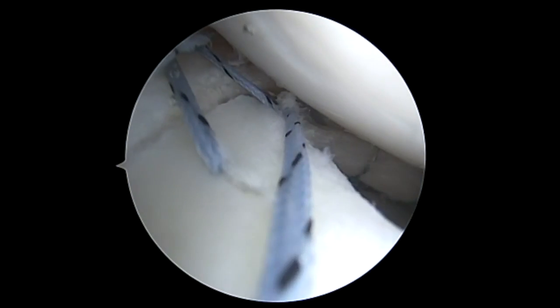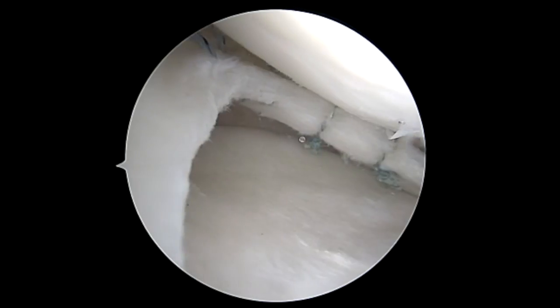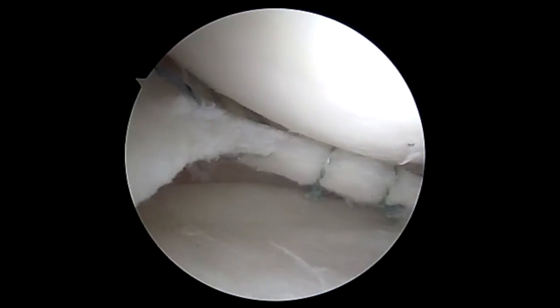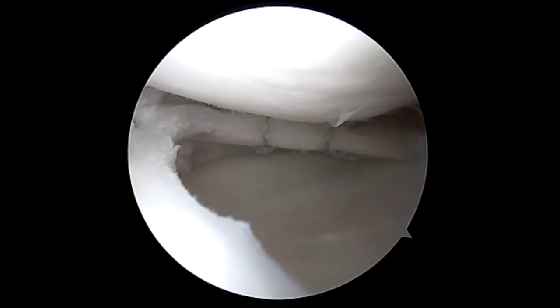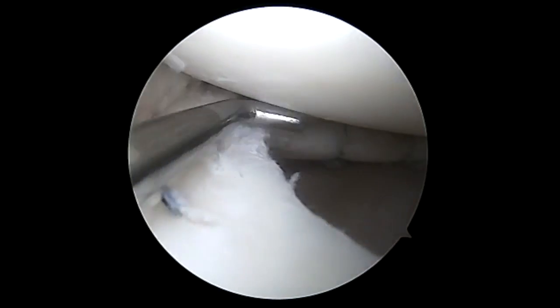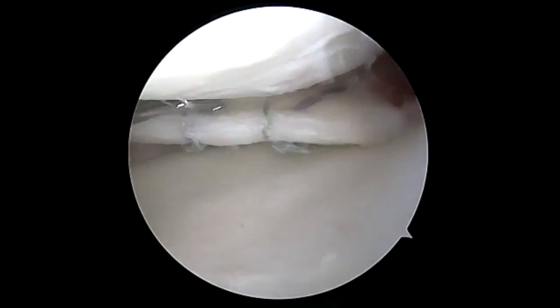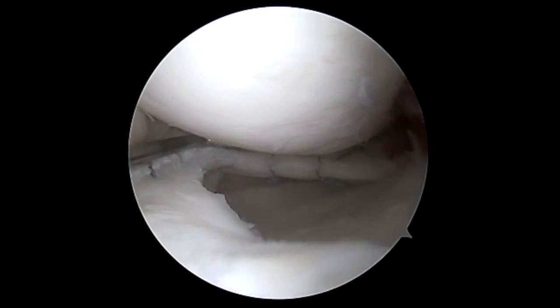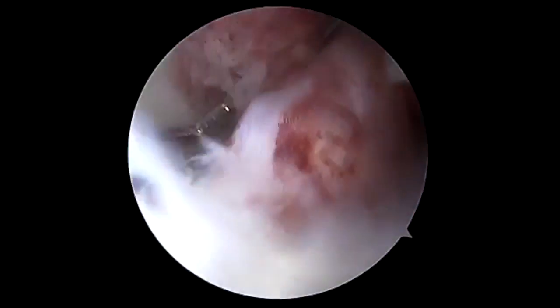Again, in this case, given the challenge of this fragment, inside out was chosen and would allow us to put more sutures in as well. You can see we have inferior fixation as well. Now we've tied this off with the leg and extension. You can see we've compressed the meniscus back. There's no further mobility, and it is well compressed back to the capsular fragment. Both the horizontal and vertical component have been repaired.